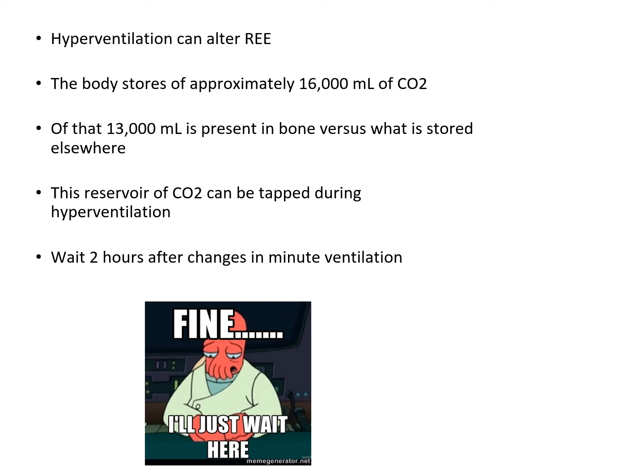Body stores approximately 16,000 mLs of CO2. Of that, 13,000 mLs is present in your bones versus what is stored elsewhere. I thought that's kind of an impressive number. This reservoir of CO2 can be tapped during hyperventilation. So you want to wait 2 hours after making any changes in your minute ventilation if you're going to obtain these measurements.